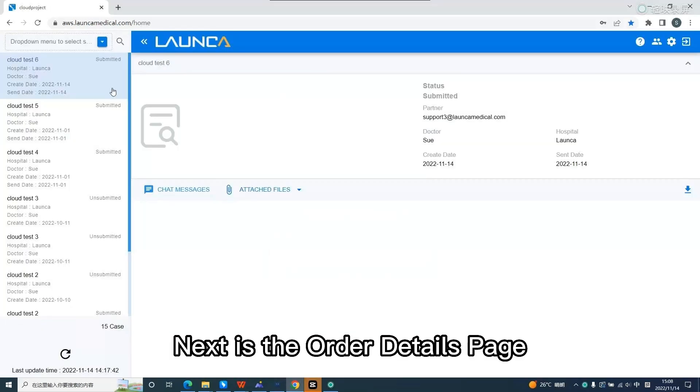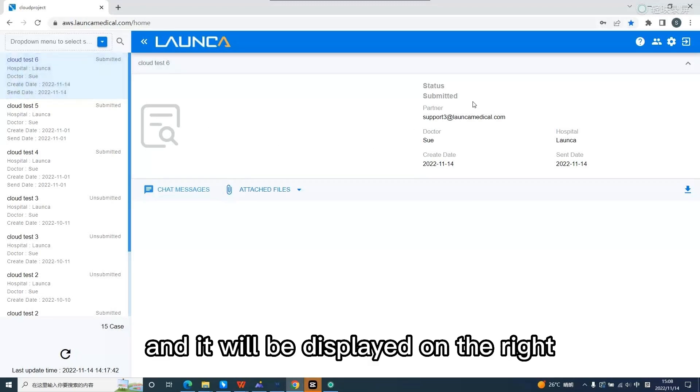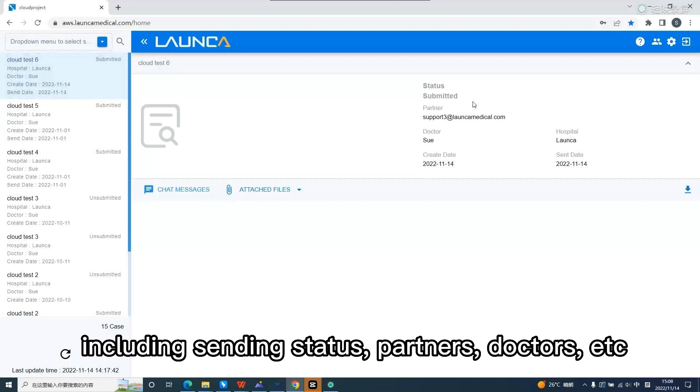Next is the order details page. Click on the order list on the left and it will be displayed on the right. The upper part is the basic information, including sending status, partners, doctors, etc.